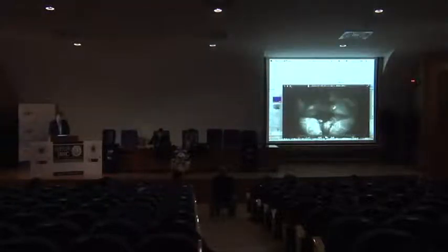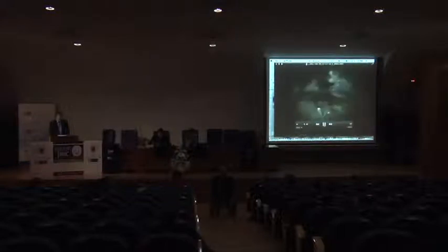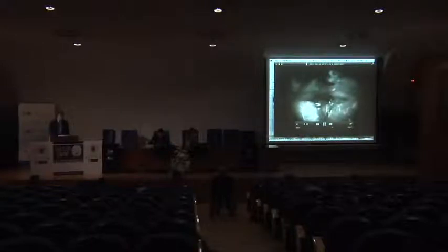You see here that vein nicely filling with the ICG injection before, and here after the clipping is in place, you see that. This is reminiscence of the ICG from the first injection. The injection of fluorescein IV, and you can filter that into the microscope and see this beautiful picture on the screen of the microscope, and you see the clips right there and the fistula disconnected.